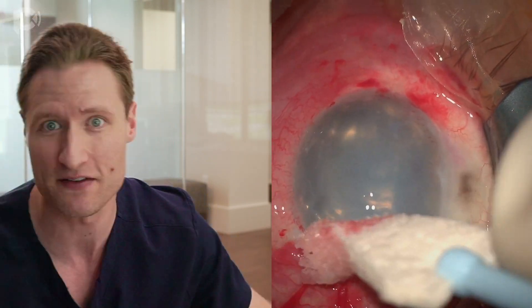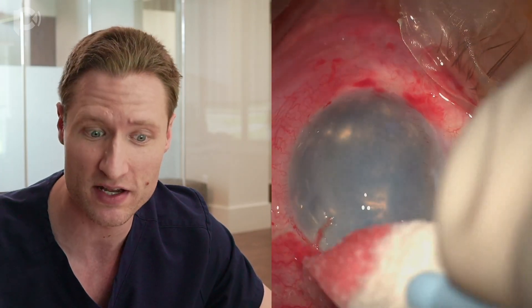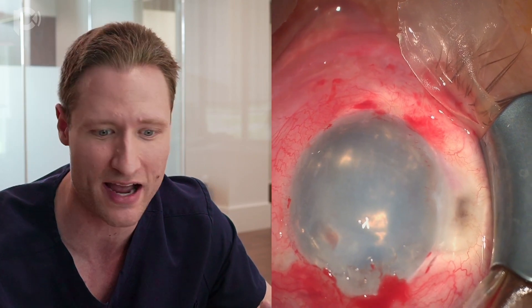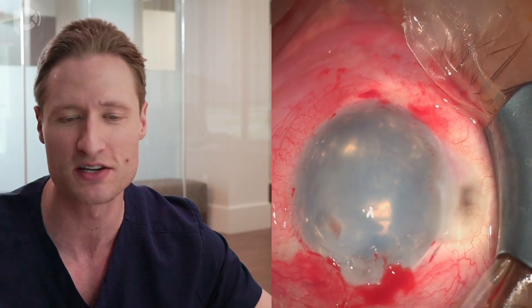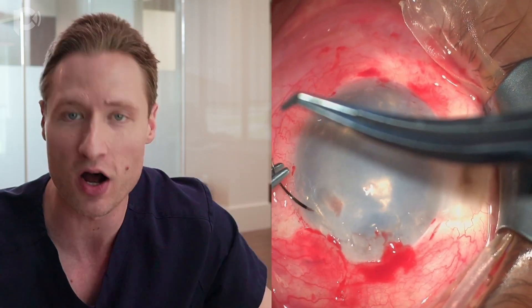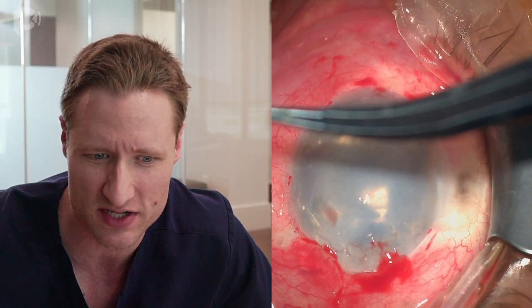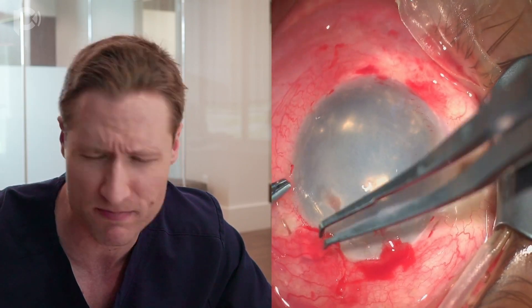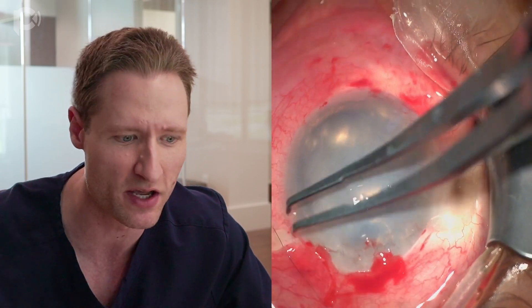Why not put a trocar in? Certainly I could have, but a trocar is a disposable expense you have to add to the case, and it's not necessary. Even though this is just a scleral flap and a stab incision into the pars plana with a 15-degree blade, the chamber was stable during the entire operation — the AC was never collapsing and there was no massive egress of fluid from the sclerostomy. So a single stab incision was a surprisingly effective way to deepen the anterior chamber without a trocar. I'm putting just a single stitch in the conjunctiva to close it over the top of the scleral flap — though honestly, maybe even that stitch wasn't necessary.